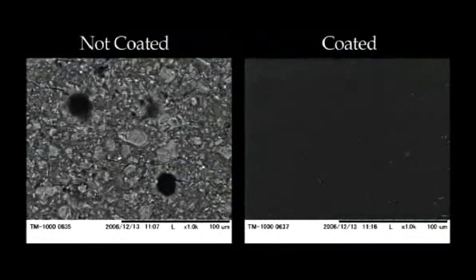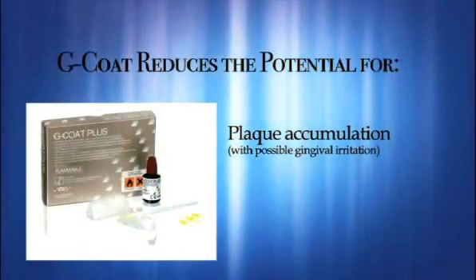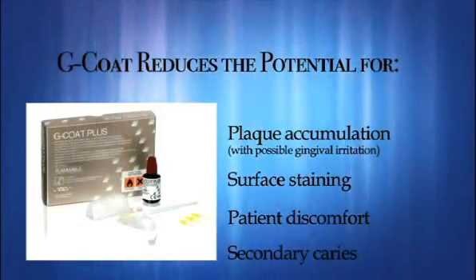This self-adhesive coating improves smoothness of the restoration by filling in the voids and surface irregularities from the finishing procedure. This reduces the potential for plaque accumulation with possible gingival irritation, surface staining, patient discomfort, and secondary caries.